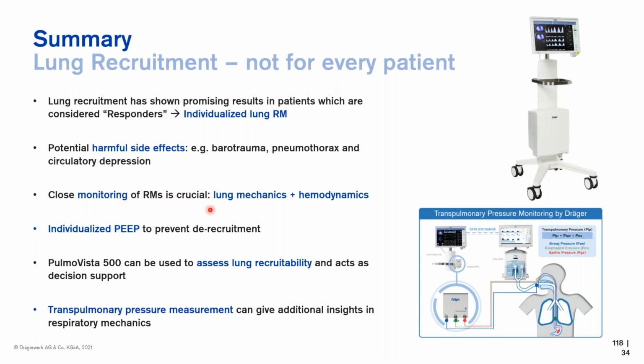Yep, and certainly there are some contraindications. There's no evidence in neonates, not much, if any, in pediatrics. And of course, anybody with intracranial pressure or severe lung damage, we certainly don't. And there's no recommendations around actually doing any recruitment in those types of patients. Yeah, also unstable circulatory system. I mean, the list of potential contraindications is, of course, also long.